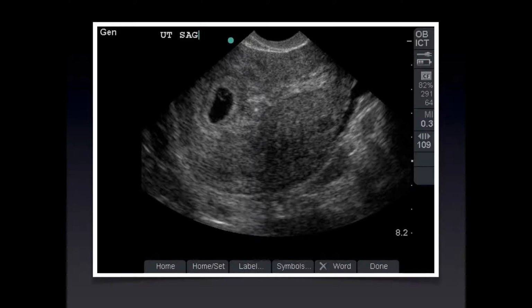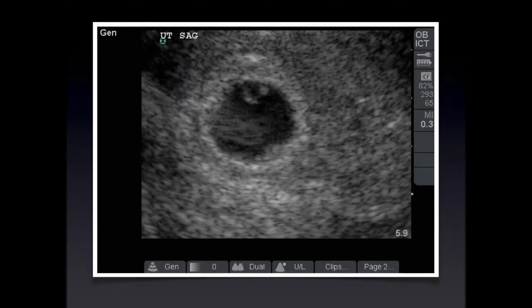Case 9. Okay, that looks boring already. There's a cervix here, connecting to the fundus there. Anterior cul-de-sac, posterior cul-de-sac, small amount of free fluid, double decidual sac sign, yolk sac. That's the definitive intrauterine pregnancy.